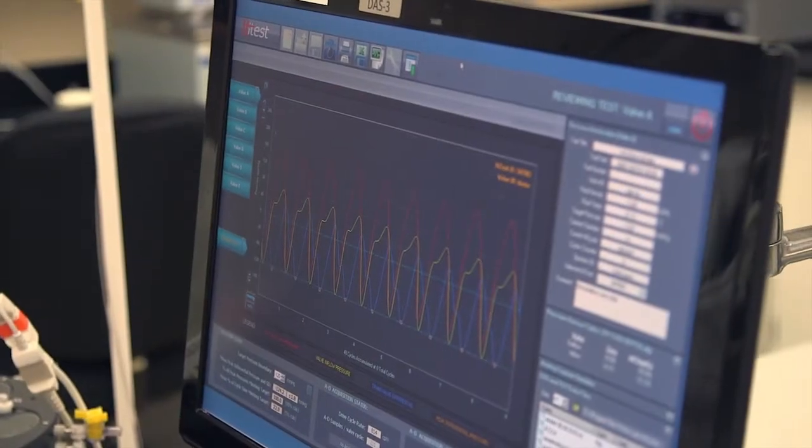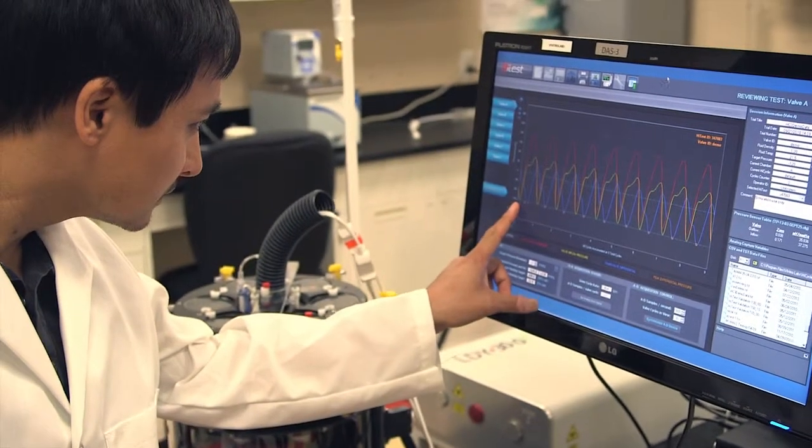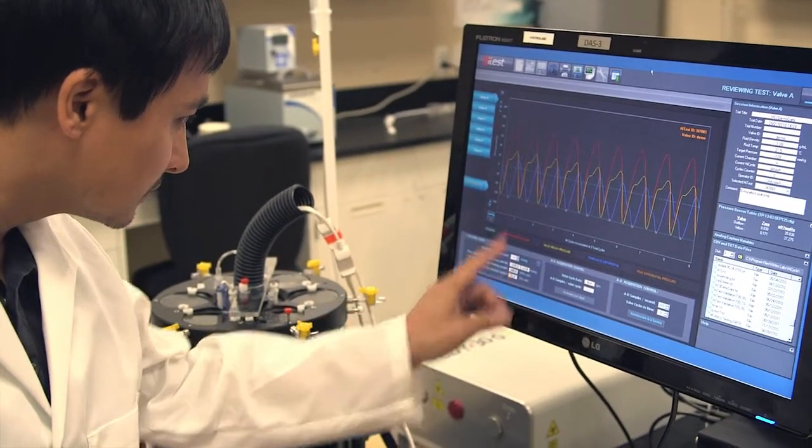When combined with the High Test Data Acquisition System, operators are able to collect and analyze pressure data according to ISO 5840 standards through an intuitive user interface.